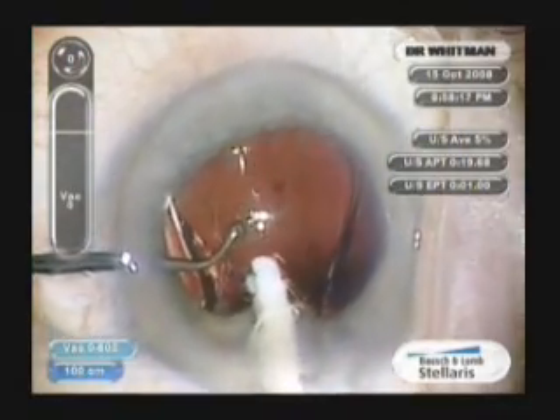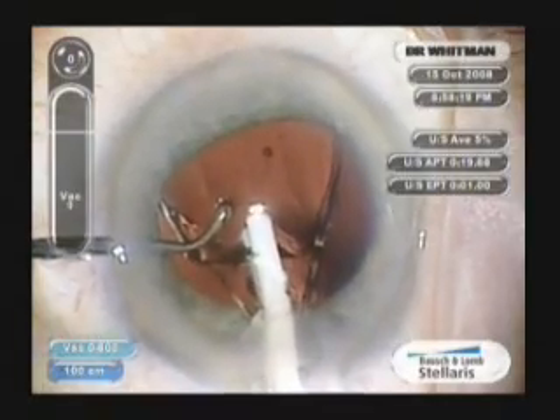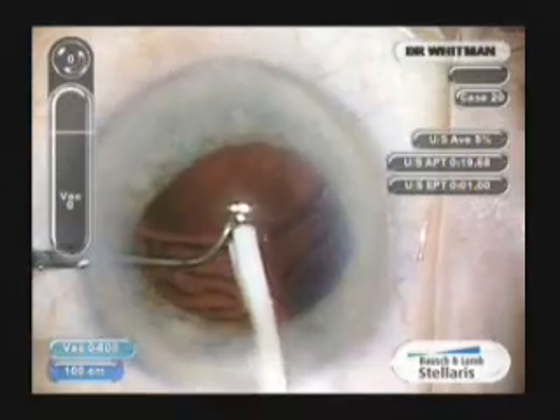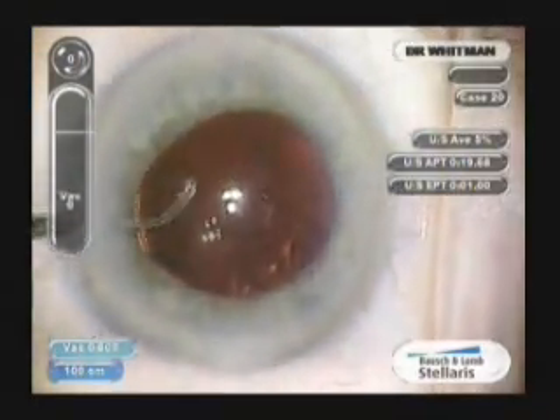Further injection allows us to drop the inferior portion of the lens, and the trailing haptics will simply fall posteriorly. Very little positioning needs to be done.